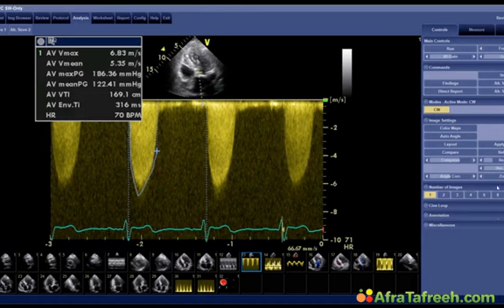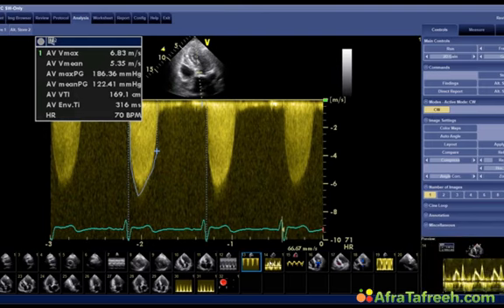By the way, all of you can ask questions if you want to. All you have to do is just enter them in your little chat box. And I'll also give you a few questions to answer, and I will take a poll later on. But first of all, I want to show you a few more loops. If you have questions with respect to the aortic stenosis, just ask them right now. I'll try to answer them while we go along.